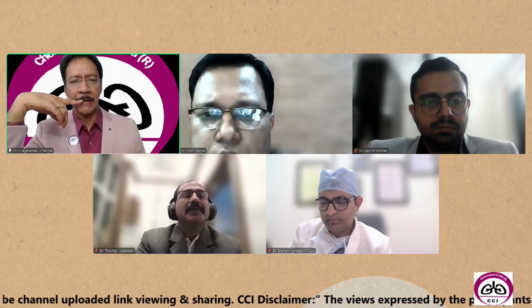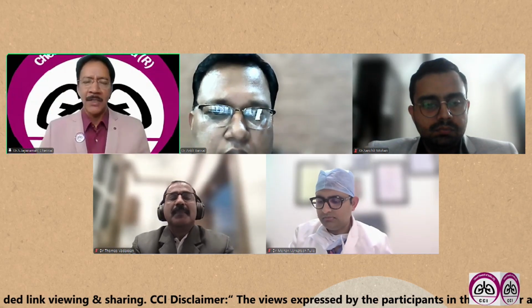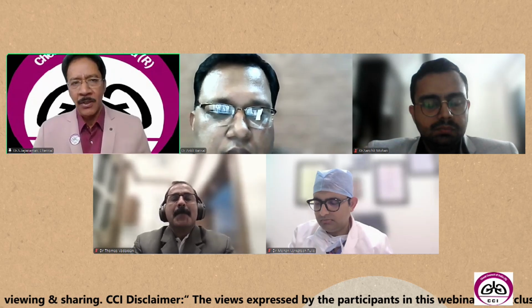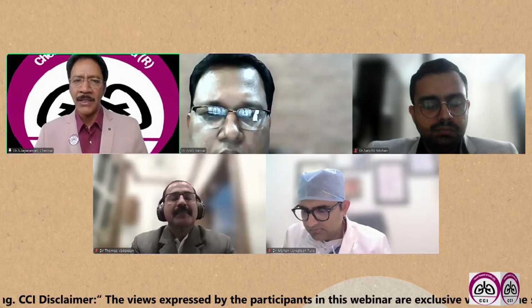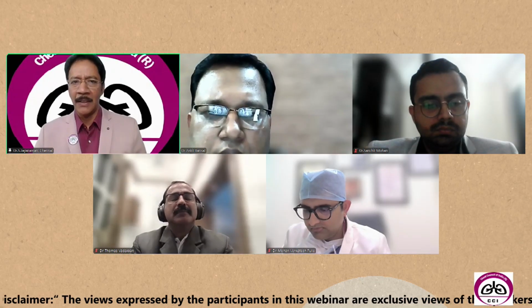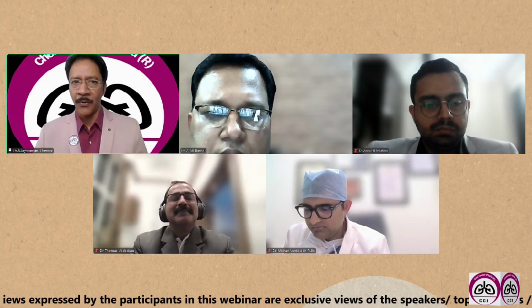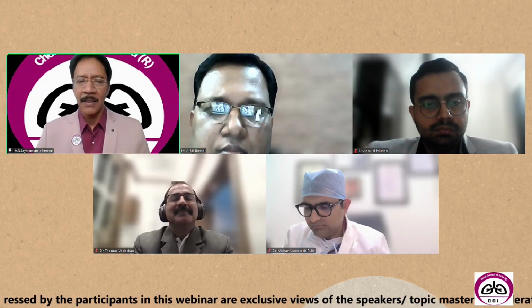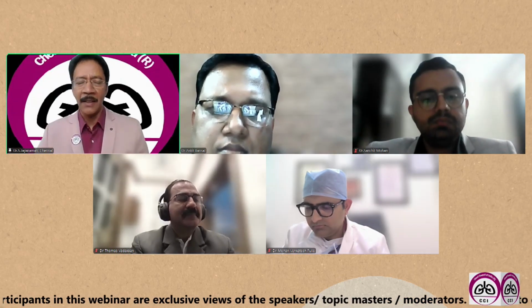Thank you, Ankit. In the pre-EBUS era, we used to do conventional TBNA using flexible video bronchoscopy. The subcarinal, that is station 7 nodes, are very easy to sample without any EBUS at all. I'm talking about two decades before. And the 4R, that is the right lower paratracheal node, if it is a big one, we can easily sample with the conventional technique.